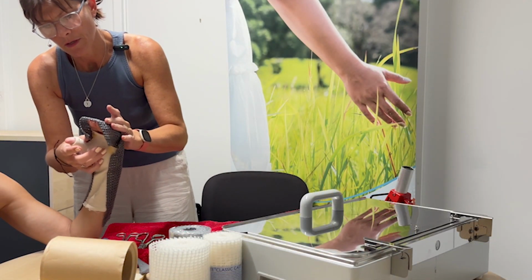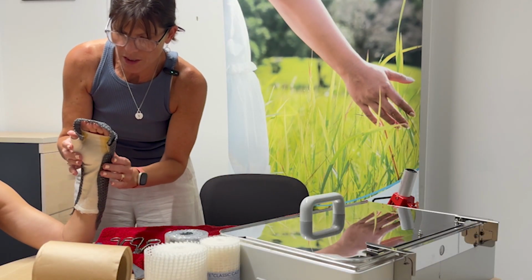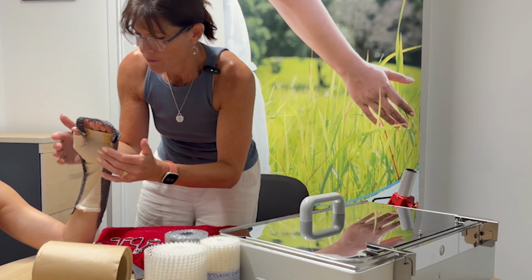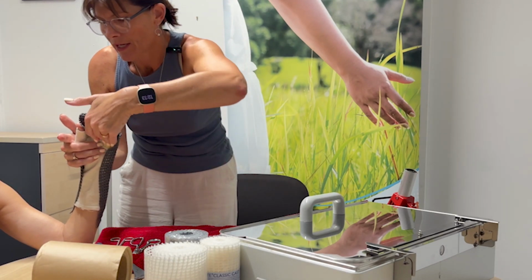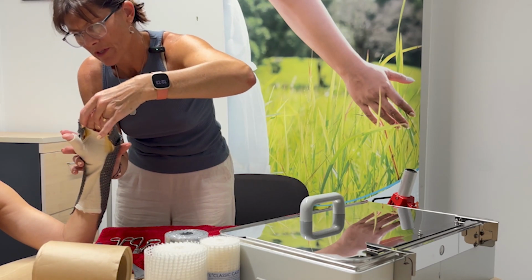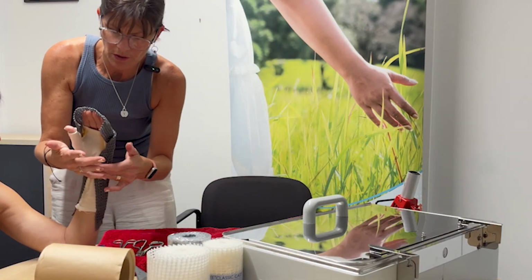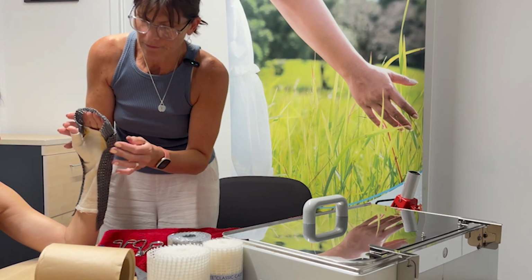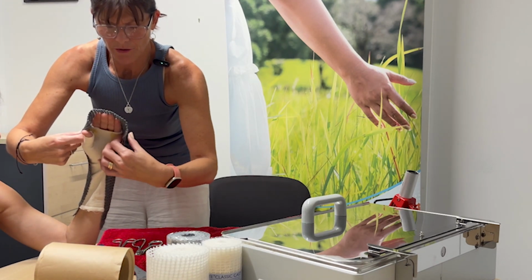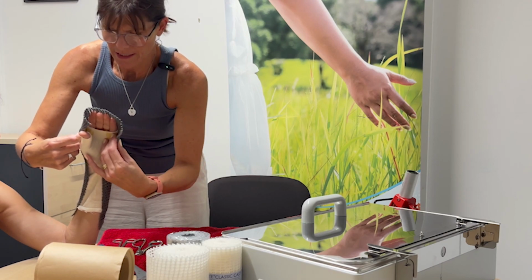Pinch your edges of the MCP joint, getting into whatever position your protocol dictates. You typically have the wrist in neutral, have the MCP joints about 50 degrees flexed and the IP joints extended, straightening your fingers a little bit more. Just molding it as you would normally. You get a really, really strong seal on those hinges there by squeezing the layers together.